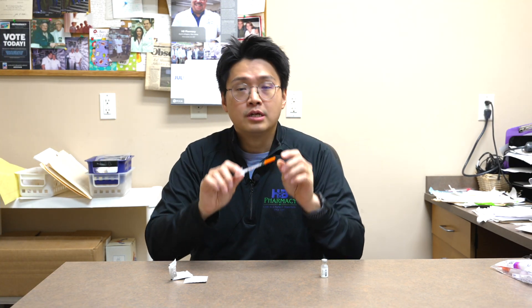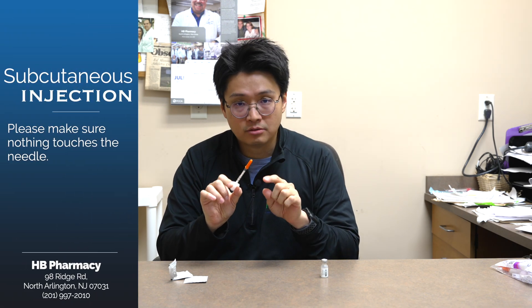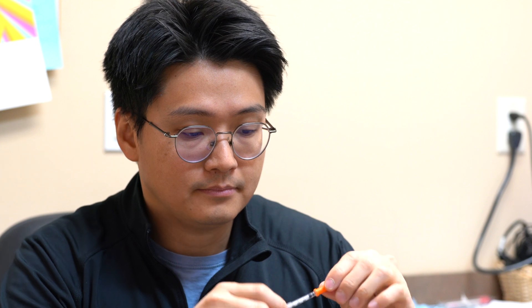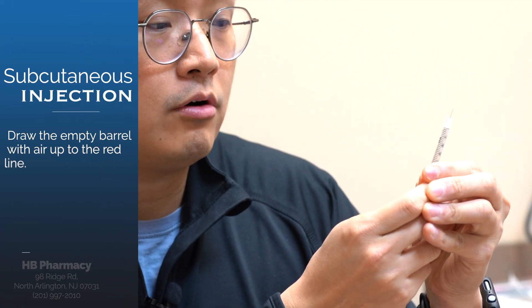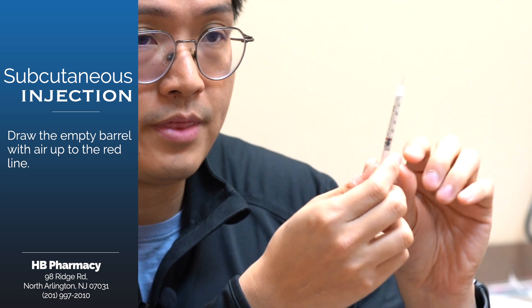Now, with this insulin syringe, the key point is that you make sure you do not let anything touch the needle during this process. It has a little cap at the bottom and the actual insulin syringe. Before you draw up the syringe, make sure you draw up the empty barrel up to the red mark as indicated, filling it with air.